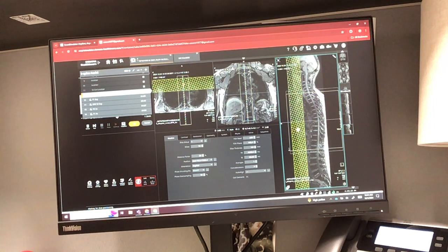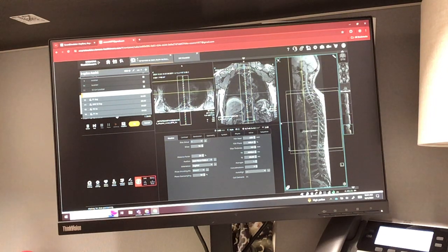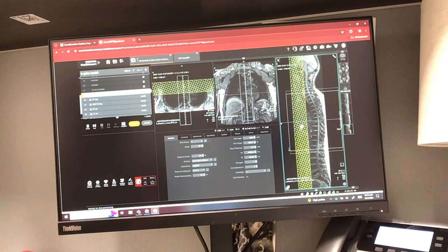I can just go ahead right now and bring this anterior rest slab in a little bit. Okay, there's my T1, there's my T12. So I'm not on top of those vertebrae, so that's good. My phase is going head to foot. There's only 10% phase oversampling on, so I'm definitely gonna wrap. So I wanna make that 100%.